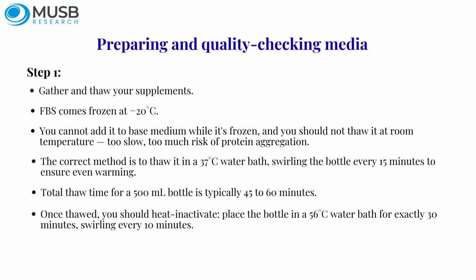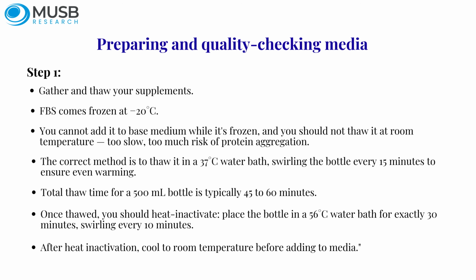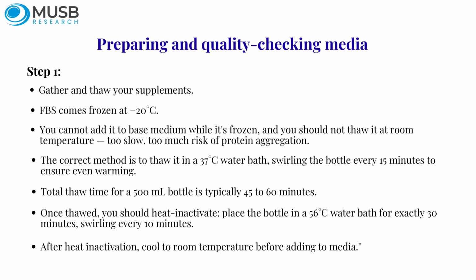Once thawed, you should heat inactivate. Place the bottle in a 56 degrees Celsius water bath for exactly 30 minutes, swirling every 10 minutes. This kills complement proteins that would otherwise damage your cells. After heat inactivation, cool to room temperature before adding to media.